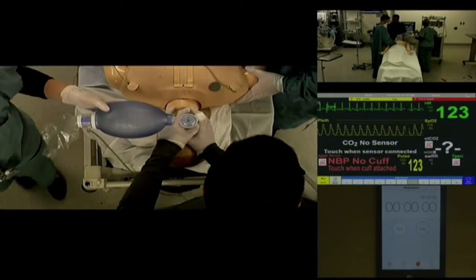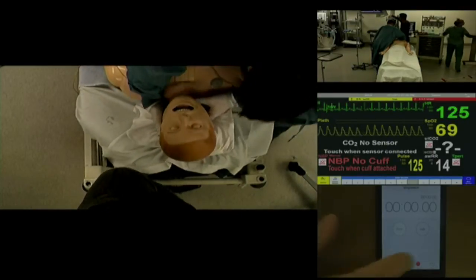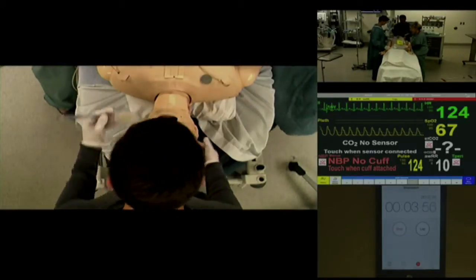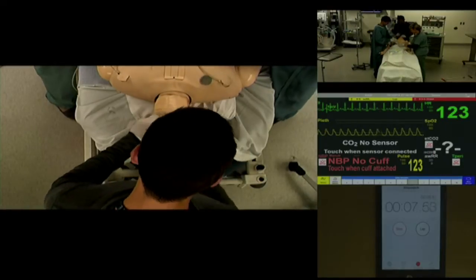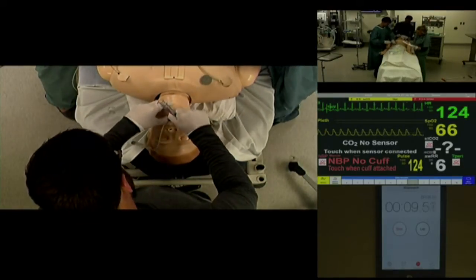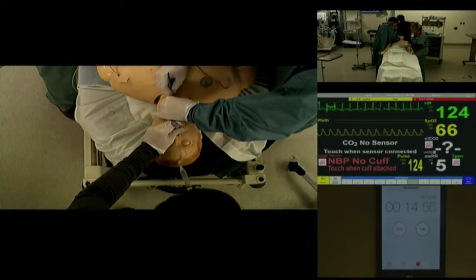Let's move to crike. Chris, can you put in an LMA please? LMA is in position.